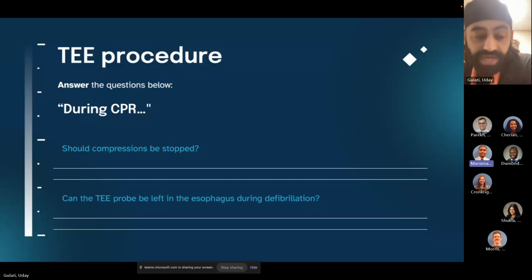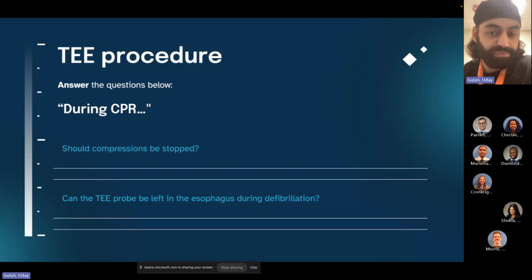I assume. But I guess I disagree. Have you guys ever put on a transthoracic echo on a patient that's in hypertensive emergency and then ends up being in profound shock the moment you give them any type of afterload reducer? I've seen it, and sometimes it's impossible to get those views. Half the time, I'm not able to diagnose it, because the patient is 500 pounds, very difficult to get good views on. They end up being emergently intubated, and now they're crashing. And then if you're lucky enough to get the view, you'll see profound MR, and then you get that blood pressure under control, and then finally they stabilize, right?